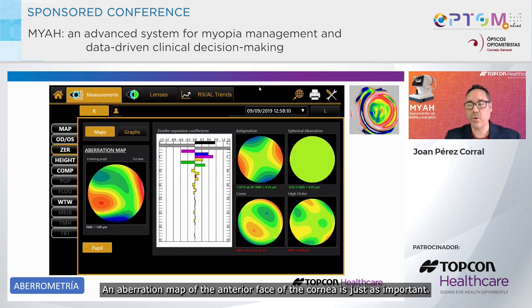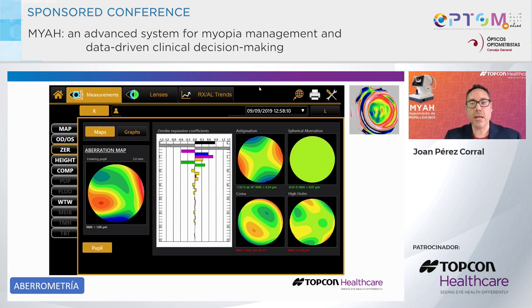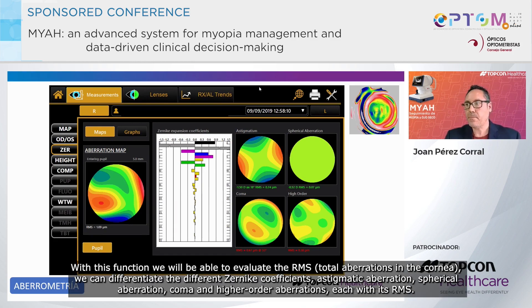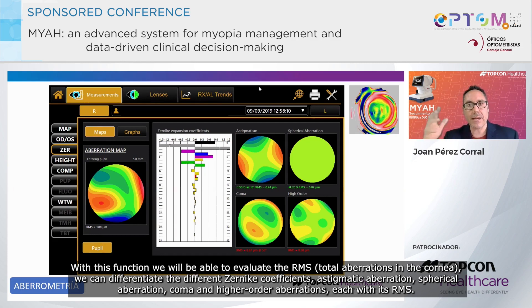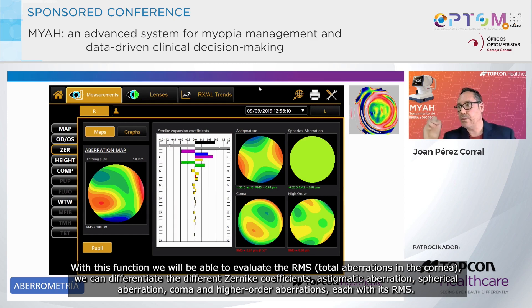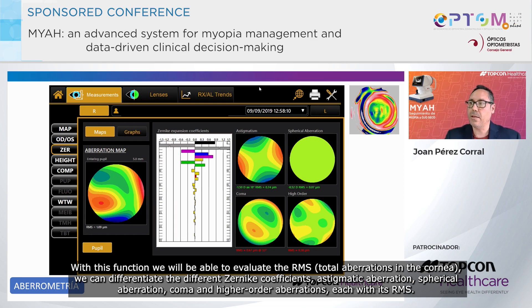An aberration map of the anterior face of the cornea is just as important. With this function we will be able to evaluate the RMS total aberrations in the cornea. We can differentiate the different Zernike coefficients: astigmatic aberration, spherical aberration, coma, and higher-order aberrations, each with its RMS.